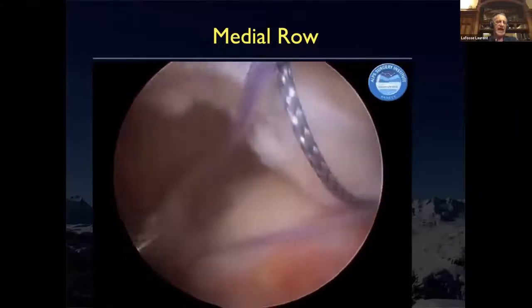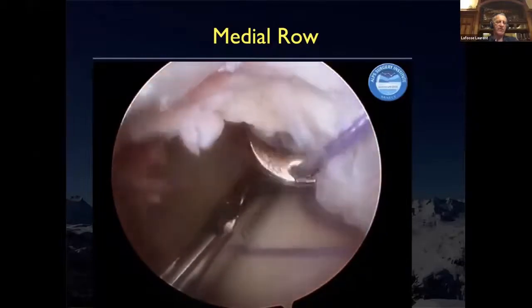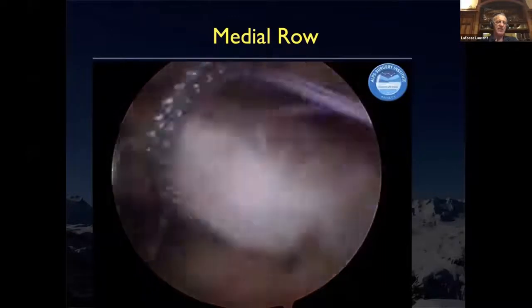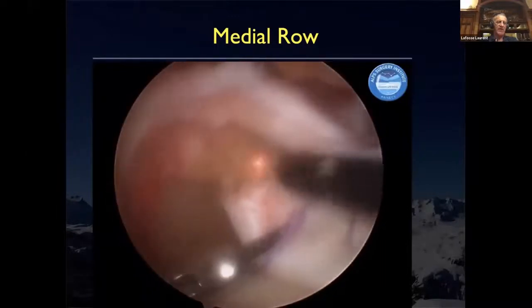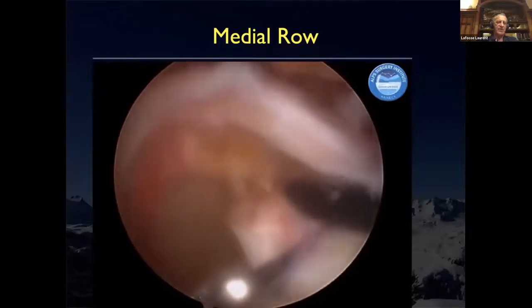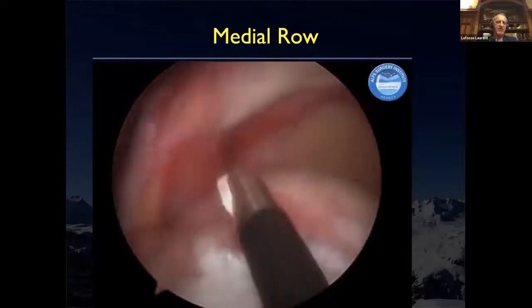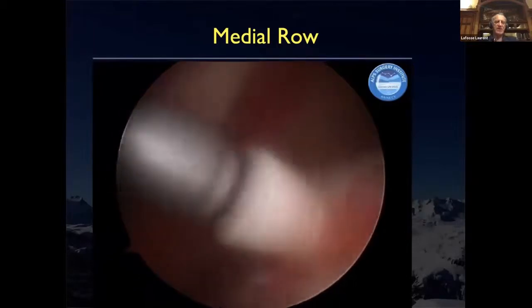And of course, I cut the biceps from the glenoid in order to have biceps continuity together with the supraspinatus, which is exactly the opposite of the very well used superior capsule reconstruction today. Just detach it. And then we have the posterior one, and then I will do the same repair as what we saw before.